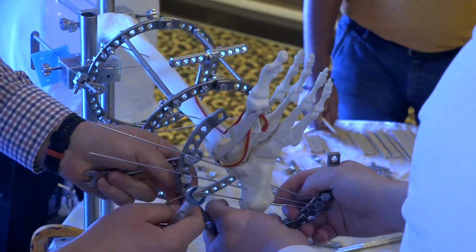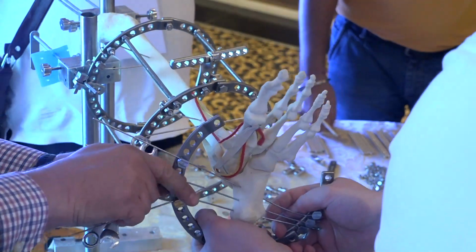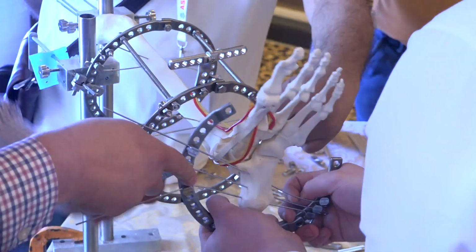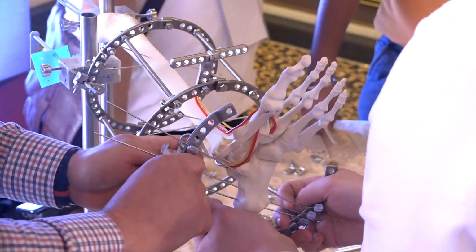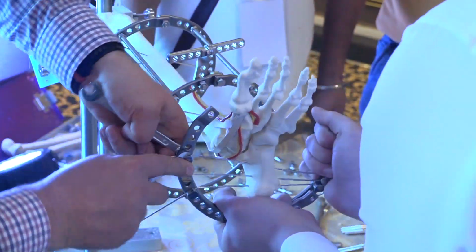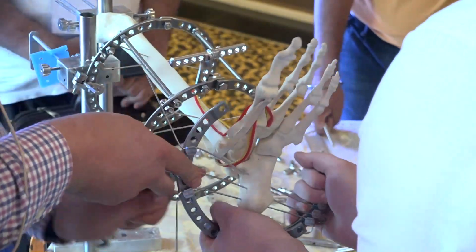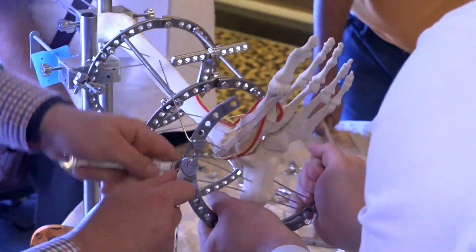And as you can see, I didn't use an automatic wire tensioner, just simple Russian style. In pilon fracture there will be a ring over here. Yes, they enable early weight bearing. It is a semi-open procedure in pilon fracture. It depends on the fracture. I mean an intra-articular fracture here. Yes, he can walk, and sometimes we have to open it to reconstruct the joint.